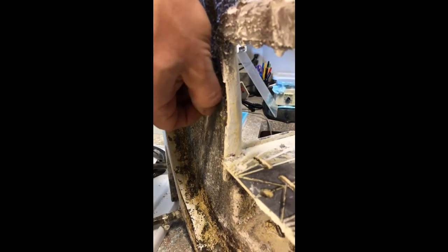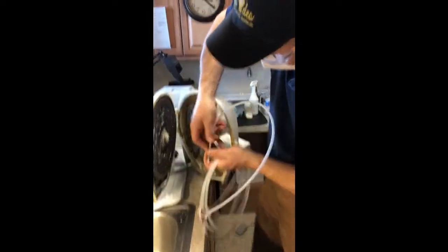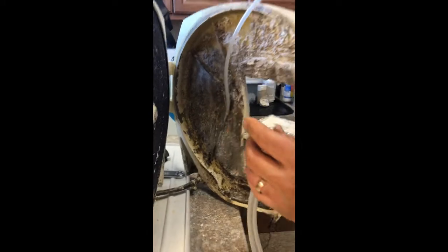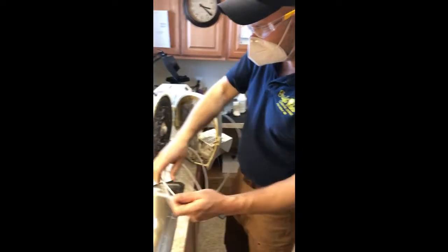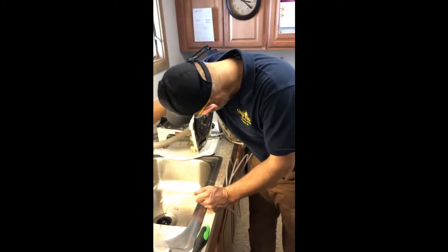I don't feel any significant blockages. So we'll push it all the way down, pull it up, and see about where we're at. It feels like we're down all the way to the end. Okay, like that. You might have to do a little creative thinking like we are to get this done. But for right now, we'll turn on the water, and we'll see if everything flows out here like we're expecting.